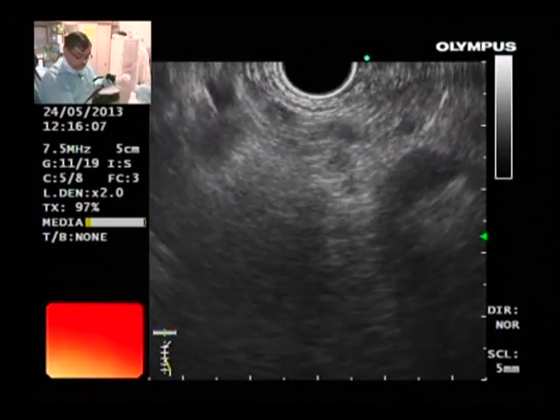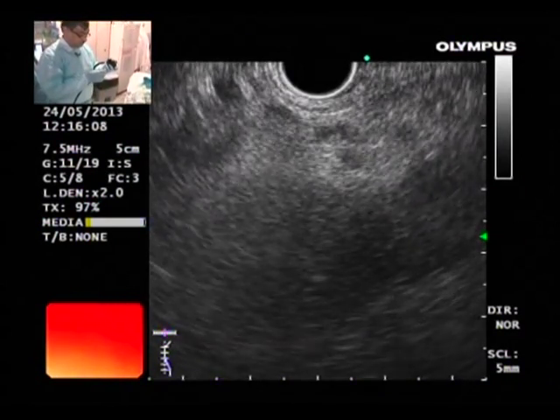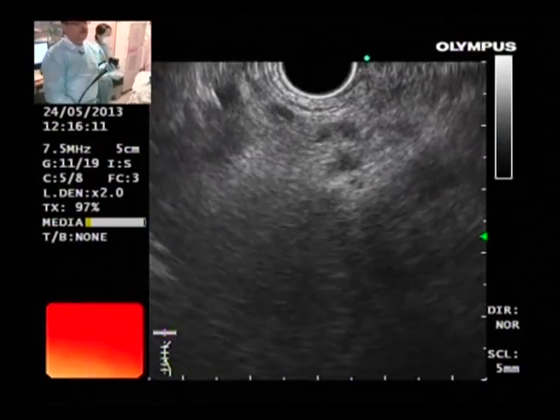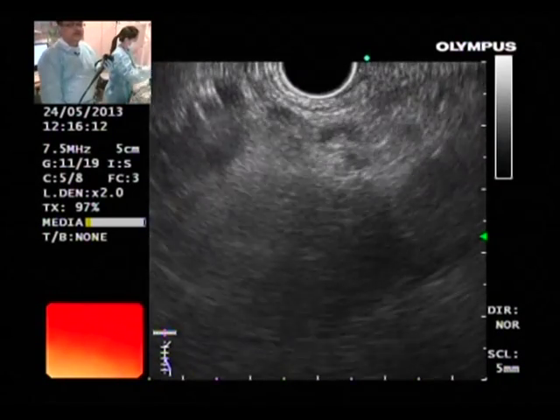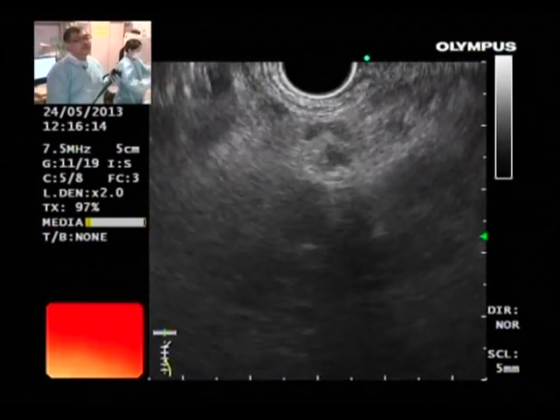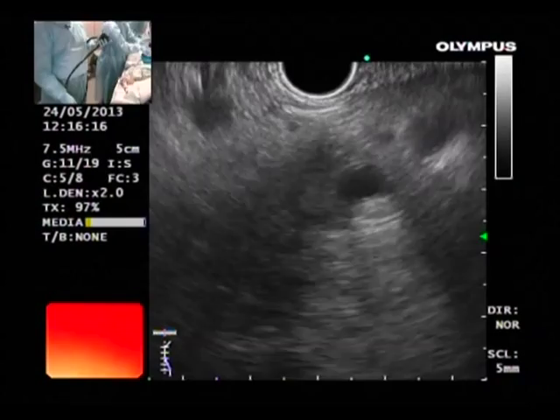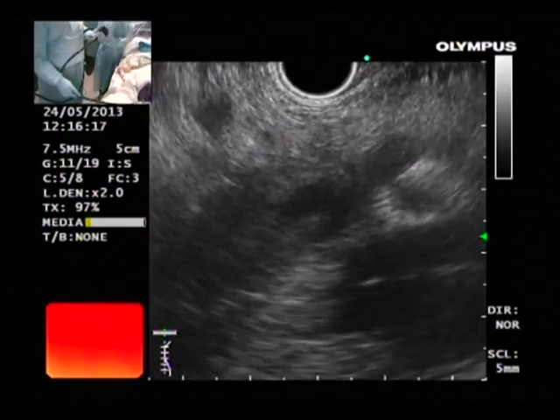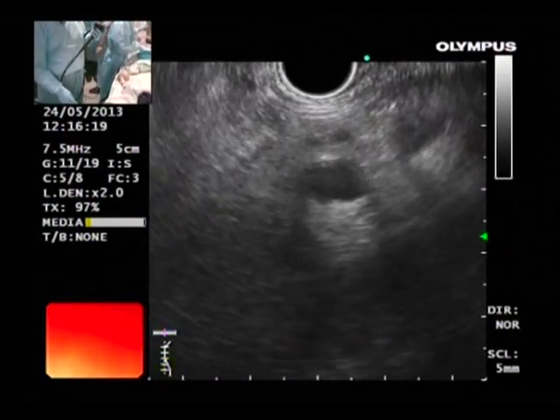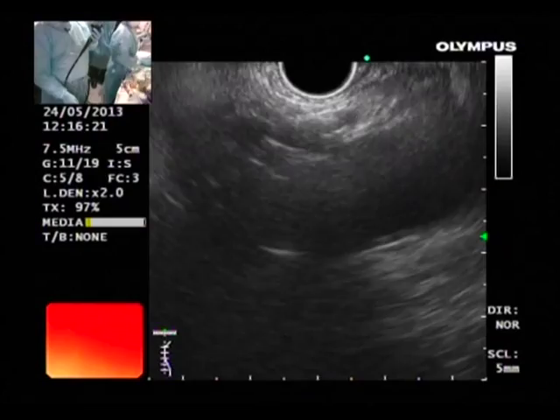I am taking out the needle now. In your experience, does troublesome diarrhea come on after this procedure? No — I haven't seen it, but it has been described in the literature. Do we need to do the FNAC on this patient? Already proved — so no FNAC needed. Perhaps we can go to the history of the next patient.